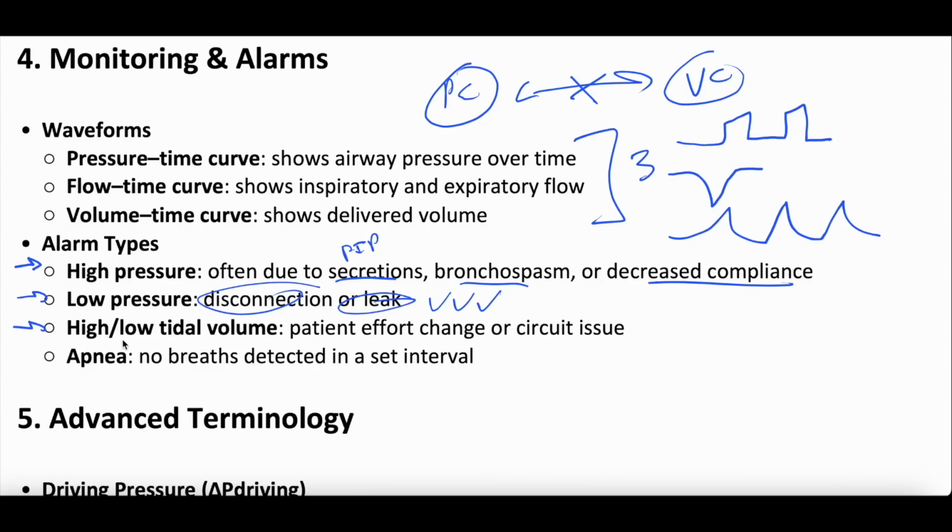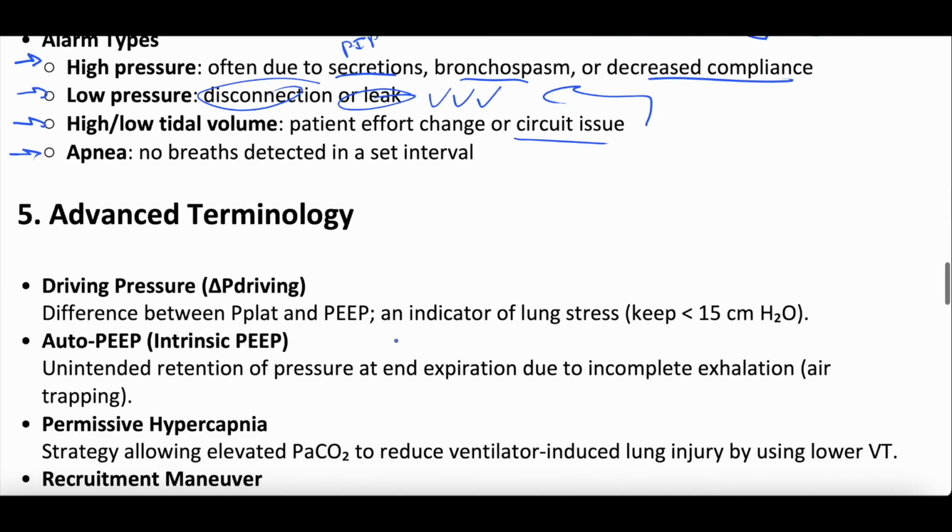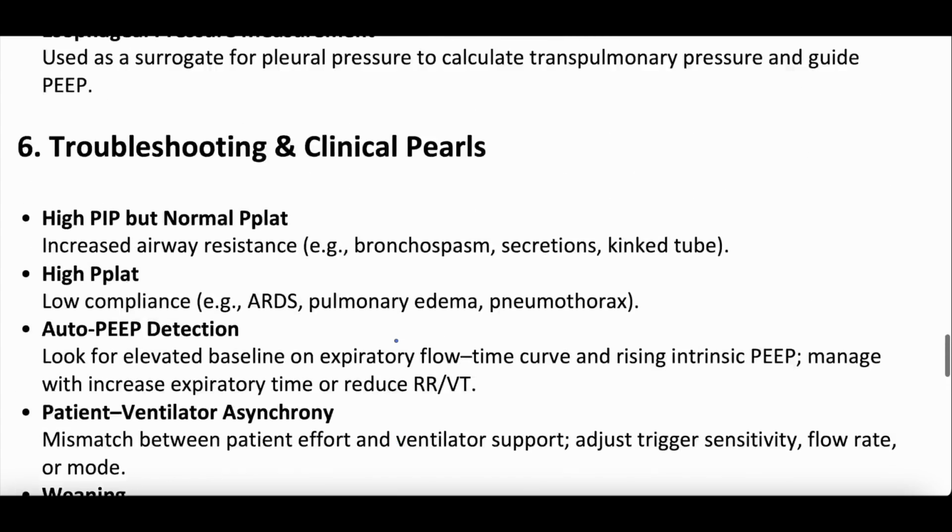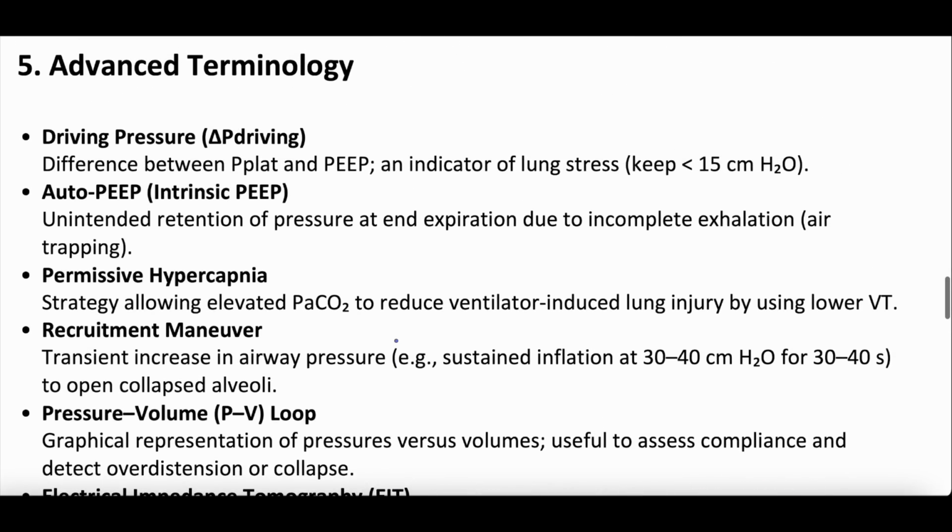High or low tidal volume alarms come on all the time. Sometimes it's a circuit issue if there was a leak. Sometimes it is a patient issue. And then apnea is essentially when the patient's not taking any breaths. You can get an apnea alarm. Advanced terminology, I think we're getting close to the end. There's advanced terminology, then troubleshooting.